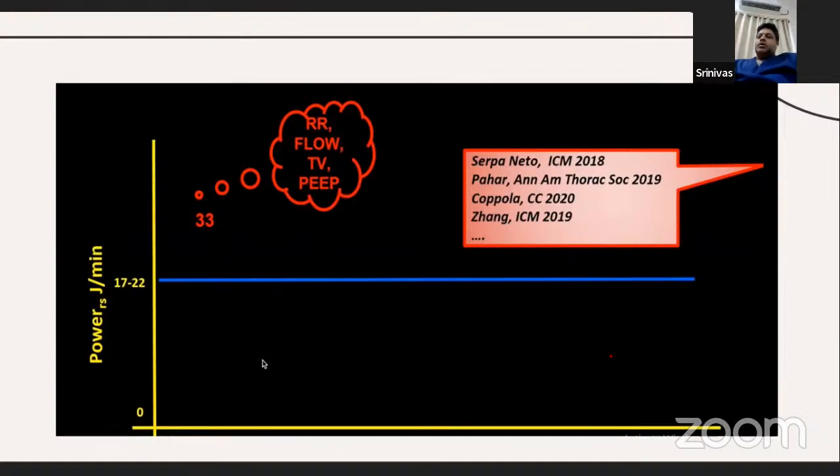Yeah, now. So when we started learning mechanical ventilation 25 years ago, it was a very intimidating and complex thing. We did not know what we were monitoring, how to wean patients. From then on, some method came in after the ARDSNet told us about tidal volume, a little bit of resistance and compliance.